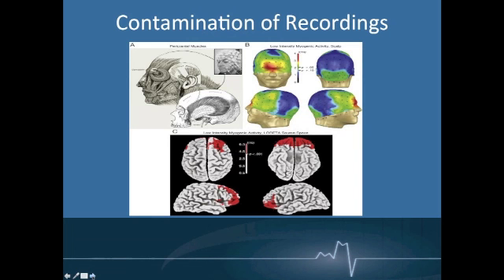Now, this is an interesting figure that I pulled from the internet. It's actually showing you something a little different than I'm going to actually talk about. But when you're reading your EMG, your facial EMG, you'll often notice that your orbicularis oculi can be a little noisy. Has anyone noticed that? Yes? Anybody have a positive experience on that? Well, it can be. It can be a little noisy, your oculi. And sometimes you struggle to figure out, is that the patient that's kind of light? Is it eye movement? What's going on here? Why is oculi the only noisy channel?